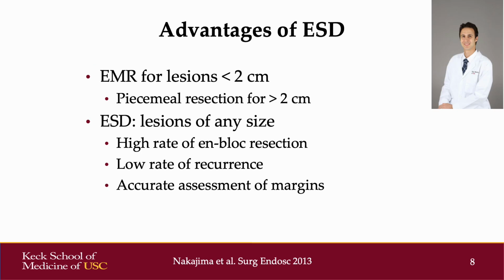ESD does have several advantages over EMR. EMR is useful for smaller lesions, generally smaller than 2 centimeters. However, for larger lesions, piecemeal resection may be necessary. ESD can be performed for lesions of any size and can have a very high rate of en-bloc resection, lower rates of recurrence compared to EMR, as well as accurate assessment of the margins of the lesion. This can be very useful when dealing with invasive cancer.